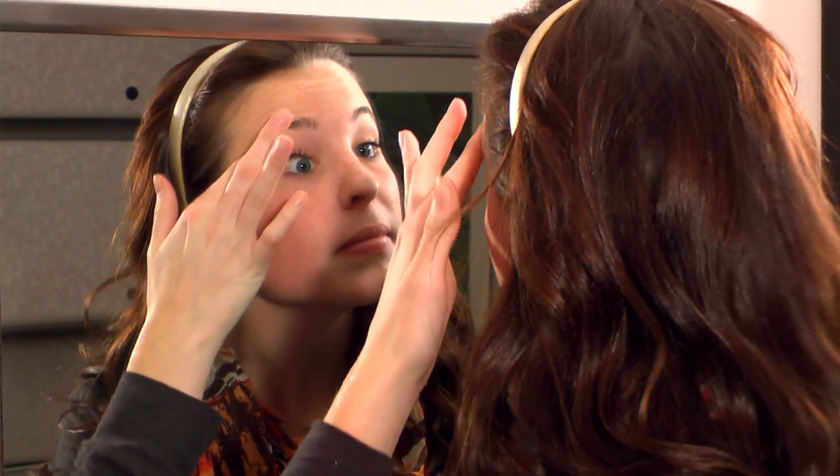Inspect your eye to make sure it's not unusually red, has secretions, abnormal blurring or pain. If you experience discomfort with the lens either on or off, call your doctor to discuss.